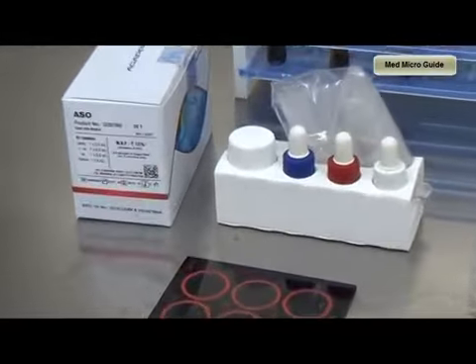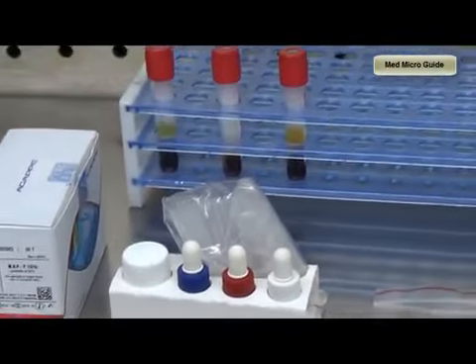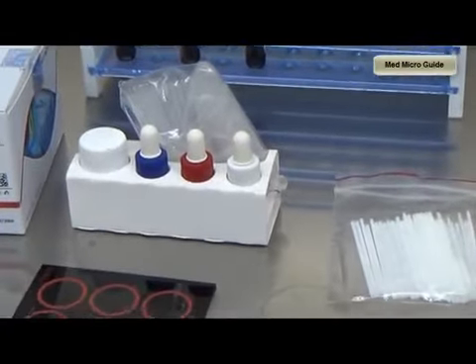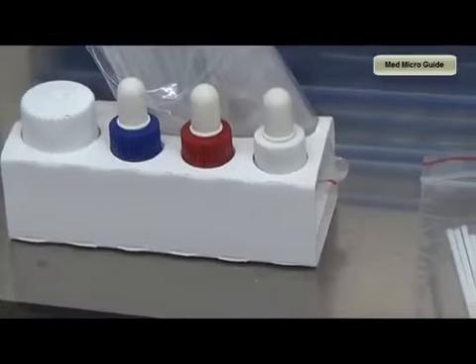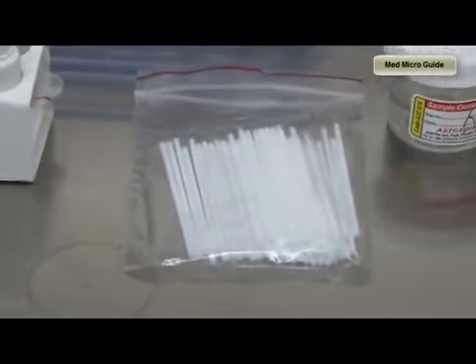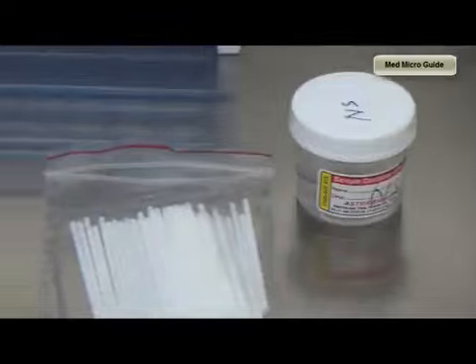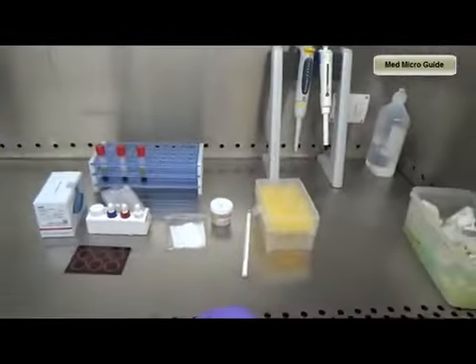Now let's see the video demonstration of the ASO latex agglutination test. Commercially available kits will provide ASO reagent, positive and negative control sera, the dilutional buffer, slide and applicator sticks. We require a glass marking pencil, micropipette and tips. The test can be done qualitatively and quantitatively. So now we will see the qualitative estimation of ASO.